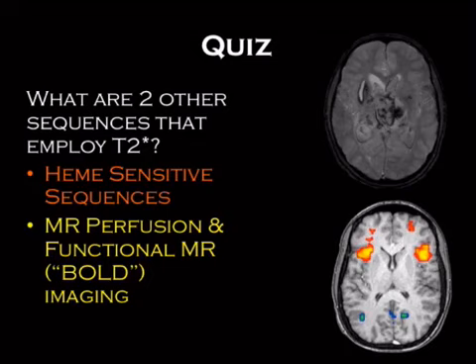But the fundamental difference is the paramagnetic properties between oxygenated hemoglobin and deoxygenated hemoglobin, deoxygenated hemoglobin being paramagnetic, whereas oxygenated hemoglobin is not. And therefore, the former will cause local dephasing of protons and thus a loss of signal from the tissues in the immediate vicinity.